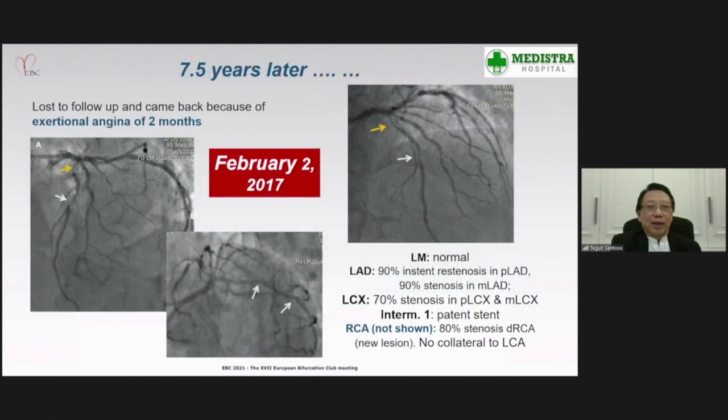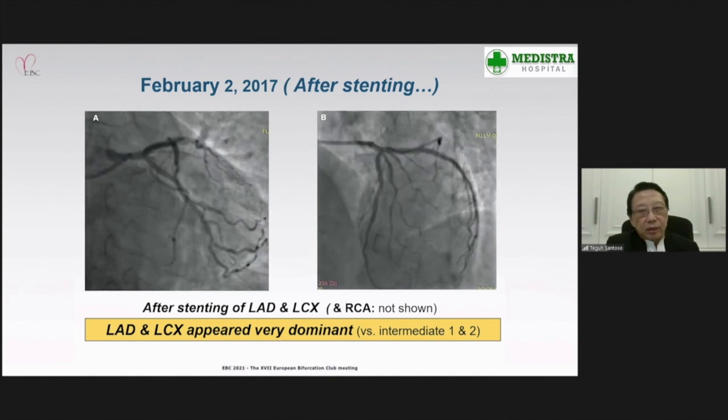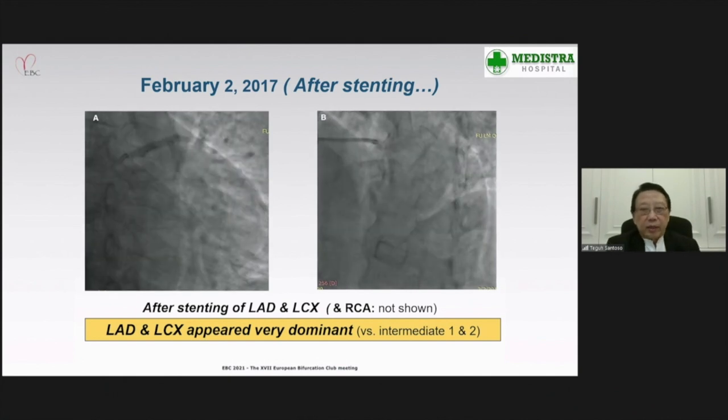The patient came back 7.5 years later because of exertional angina for 2 months, and the angiogram showed in-stent restenosis in the proximal LAD, a new stenosis in the mid LAD, and new stenoses in the proximal and mid LCX. So we fixed this with two overlapping stents in the LAD, a good result, and also two overlapping DES in the LCX, and we obtained an excellent result. This is just to show the result after stenting. LAD and LCX appear dominant as compared to both intermediate branches.